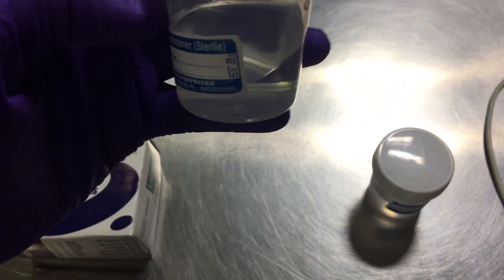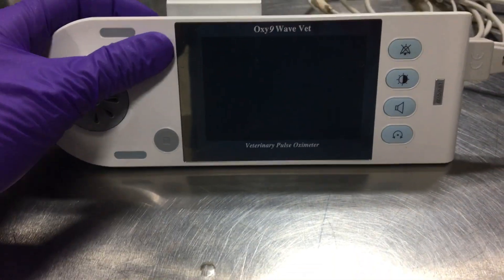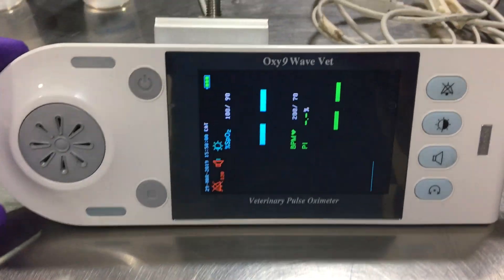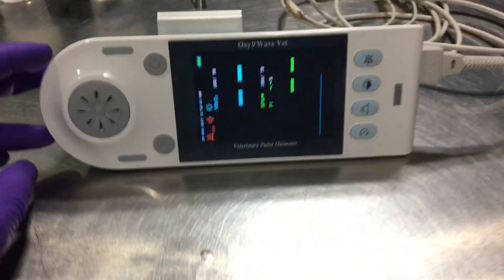We have some glass slides and a box to carry the slides. We have two containers filled with 10% formalin to keep the tissue for histopathology. We also have a portable pulse oximeter, as the whole biopsy procedure will be done under general anesthesia.